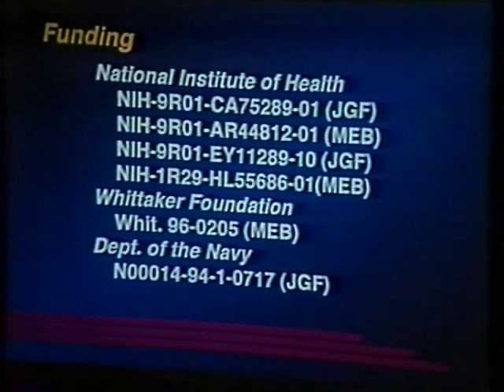This, first of all, is a backwards slide, I apologize, and it's also not cardiovascular tissue. There's a variety of forms of spectroscopy you can use with OCT, and one of them is polarization-sensitive imaging. One of the first changes you get in osteoarthritis is a change in the collagen. Collagen is very highly organized, and it also turns out to be polarization-sensitive. So when we change the plane of polarized light from the source, this is normal cartilage, you can see that the backscattering intensity changes at the same site. So this area is polarization sensitive.